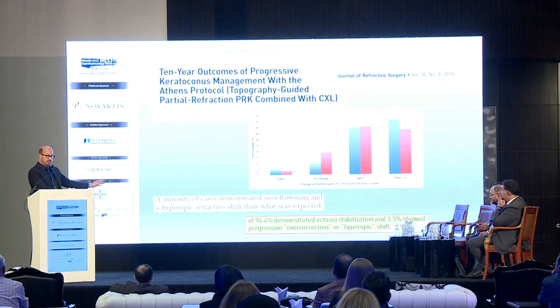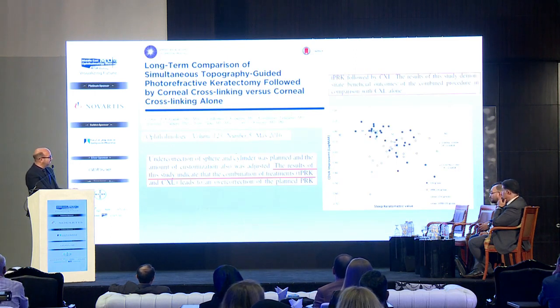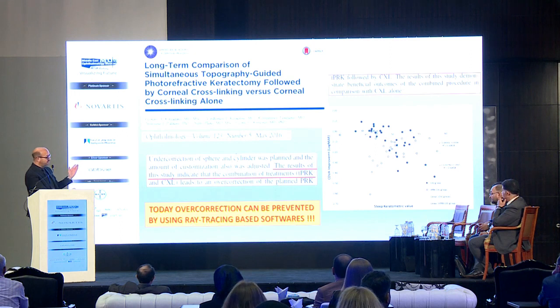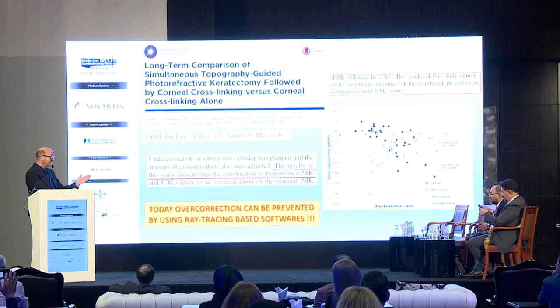Which was the complication? The complication for the full anterior regularization was the overcorrection. In the literature, the overcorrection was reported. But thanks to ray tracing, finally, we can calculate the posterior surface, so we can avoid this kind of complication.